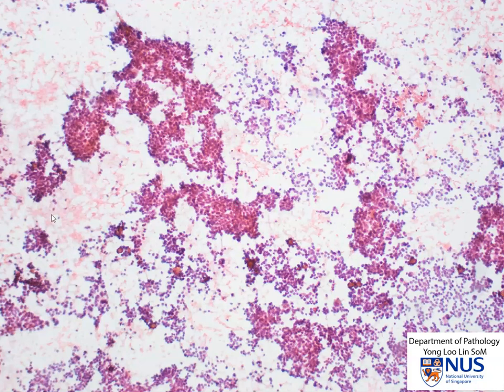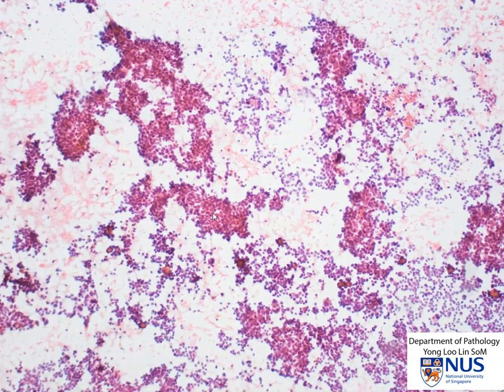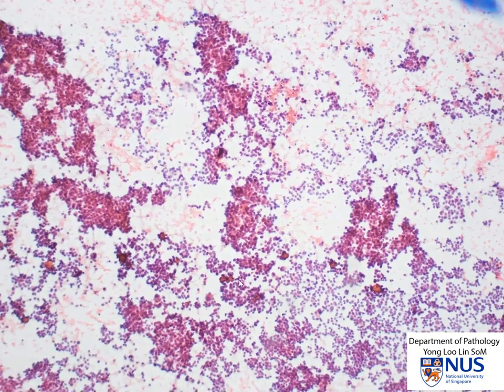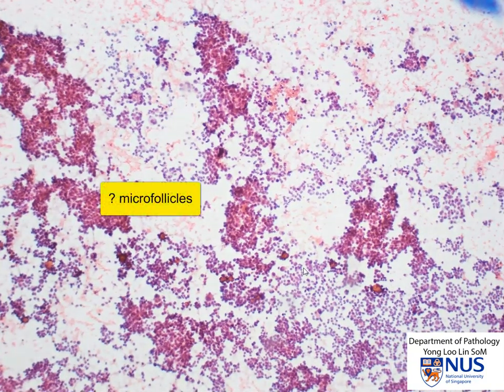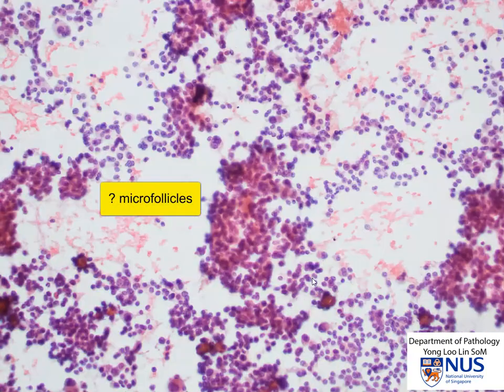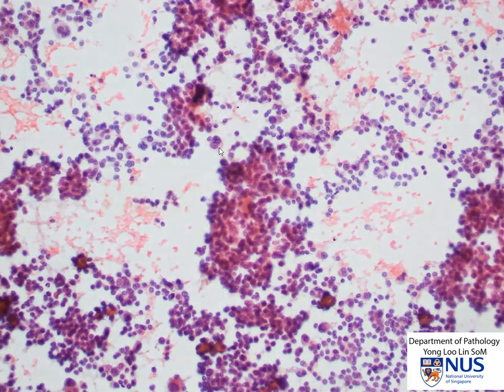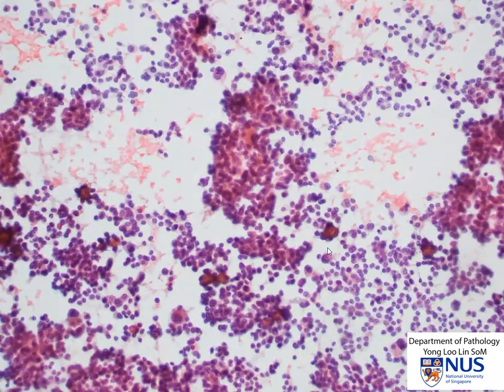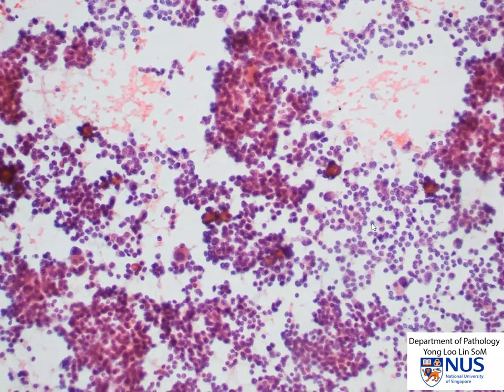In the corresponding alcohol-fixed Papanicolaou stain smear, again we see that it is very cellular. There is actually a suggestion of microfollicular formation in some areas, and again we can see binucleated cells. Most of the cells are quite polygonal and plump, or epithelioid.